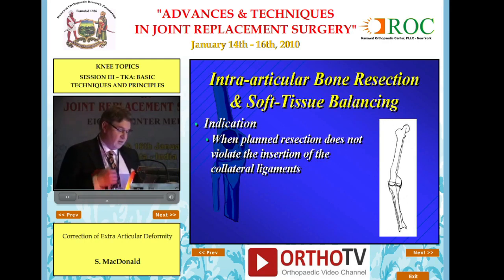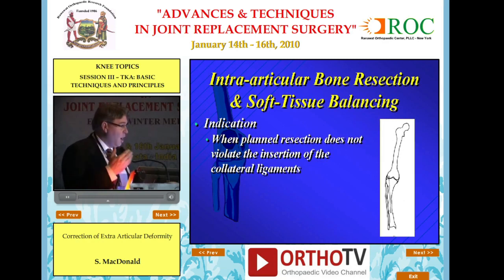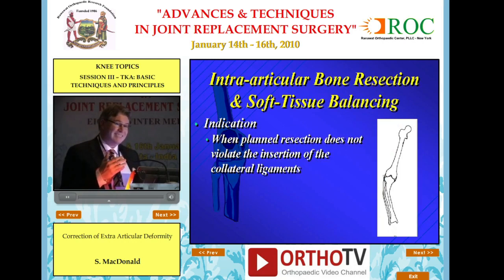If, on the other hand, you plan it out and the correction is above, in other words, you're going to be compromising the insertion or the origin of the collateral ligament, then it's a little different story, because you're not going to be able to do that correction at the time of the OR. So let's go through that.